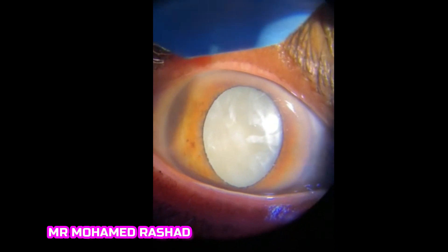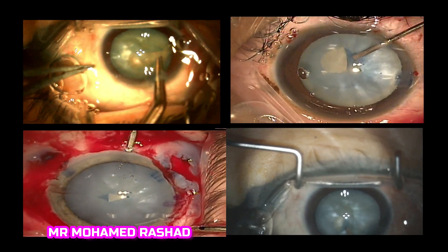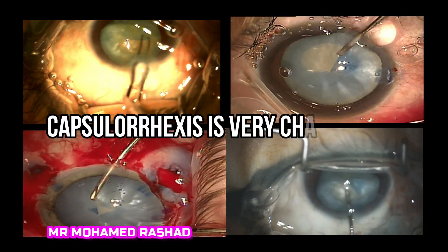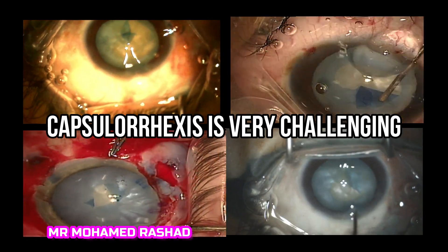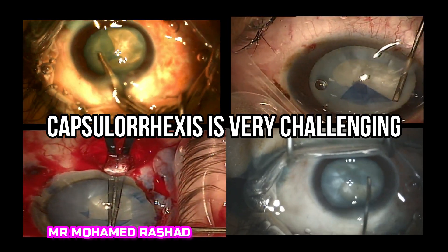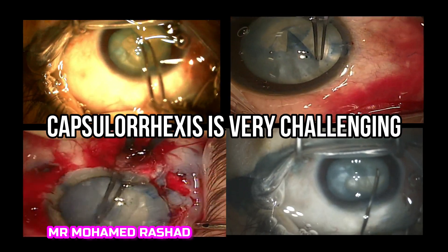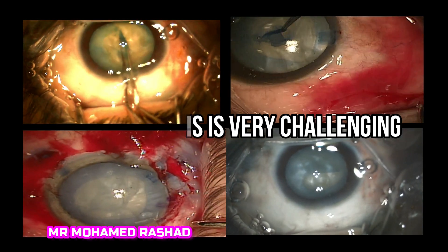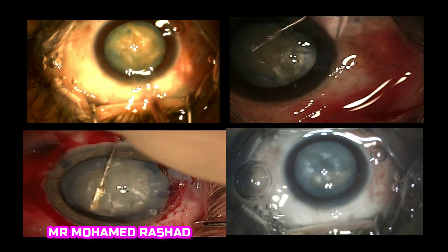Intumescent white cataract is always a very challenging case, and the most challenging step is doing the capsulorhexis in this very tense capsular bag. There are a lot of techniques that have been described before, like needle puncture technique, spiral capsulorhexis, and double rhexis technique, but they are not always successful.